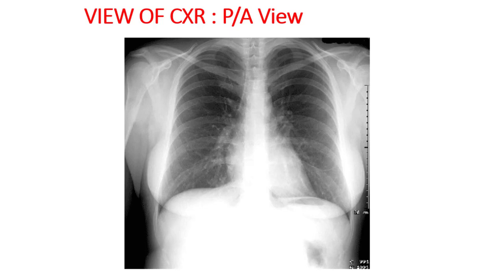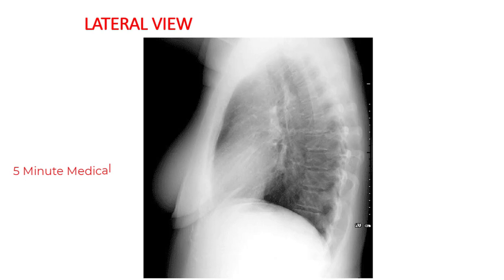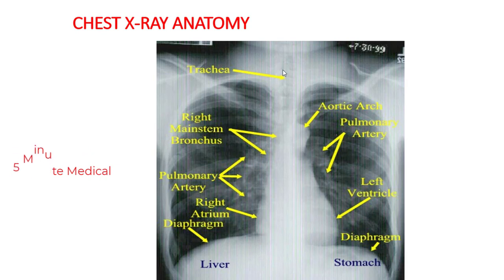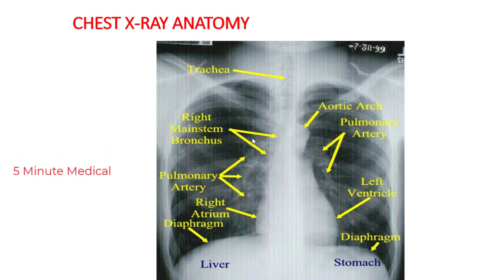First of all, this is the normal chest X-ray posterior-anterior view, and this is the lateral view chest X-ray. This is the chest X-ray anatomy. The structures we usually read in a chest X-ray: first, the trachea — is it centrally placed or not — then the right main stem bronchus and the aortic arch.